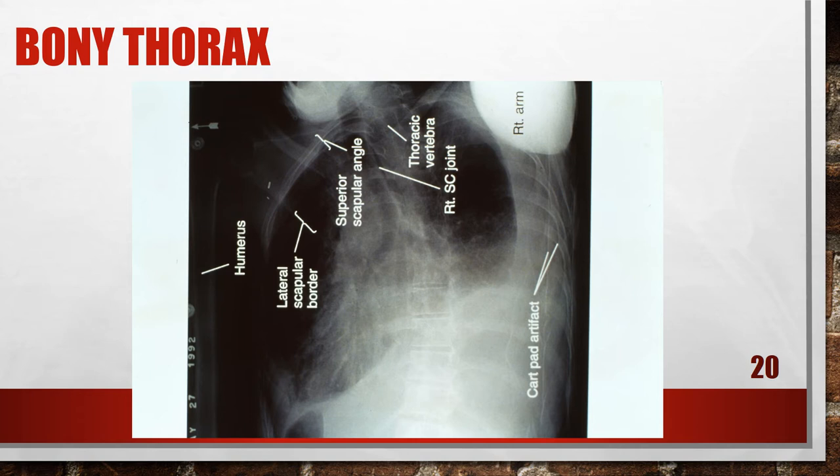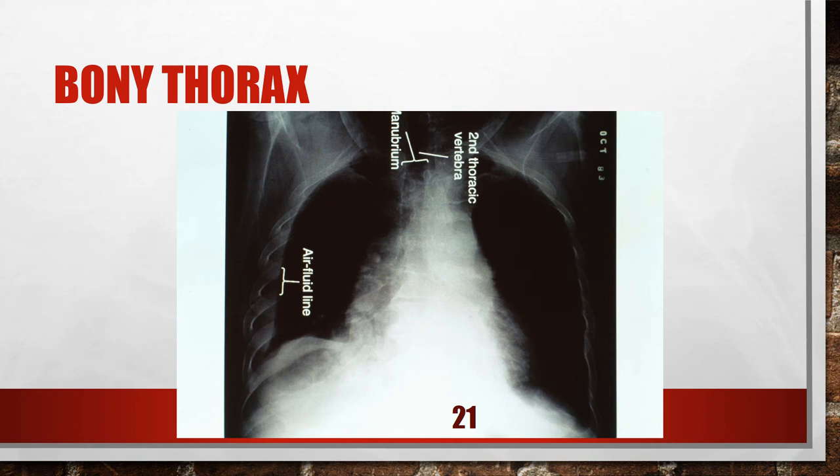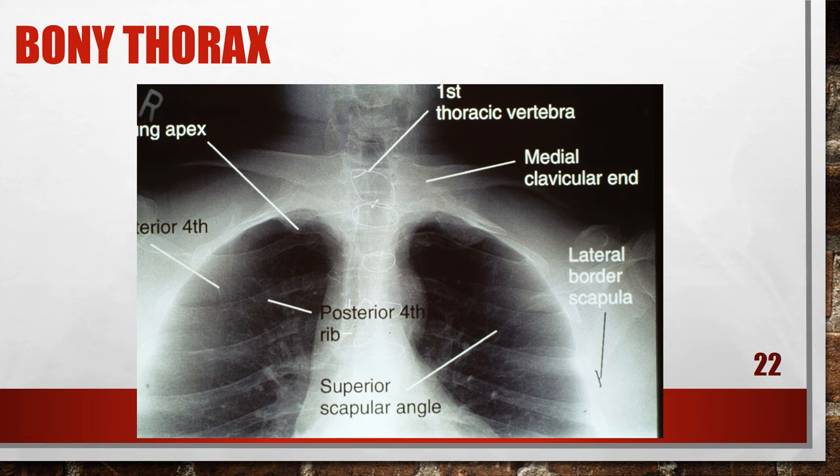This is a decubitus chest that is rotated. You're also seeing the cart pad as an artifact on the x-ray, and the right arm as an artifact on the x-ray. You can see that the chest is rotated by looking at the anatomy on the film. This is a decubitus chest with a tilted mid-coronal plane — you need to make sure that the patient is parallel to the image receptor.